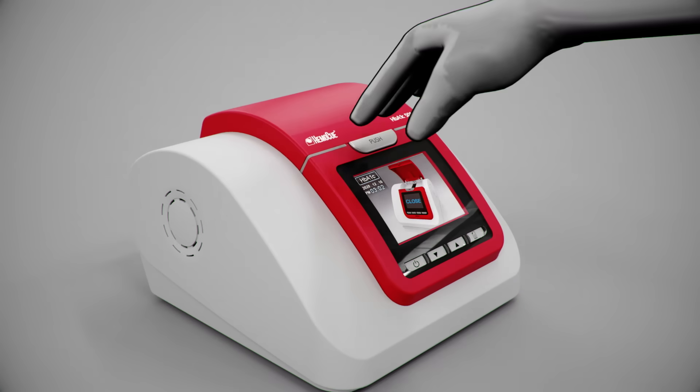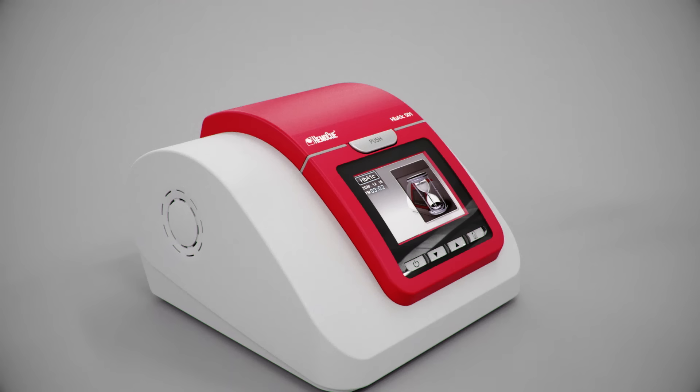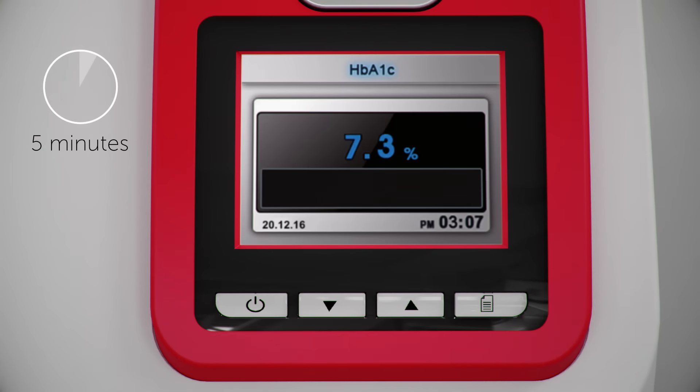Close the lid. The test will then start automatically. The result is displayed after five minutes.